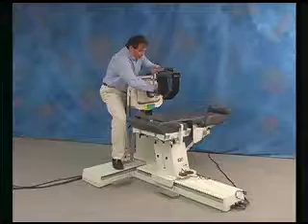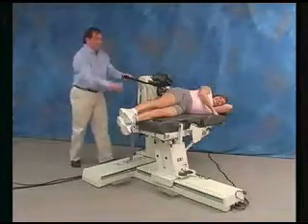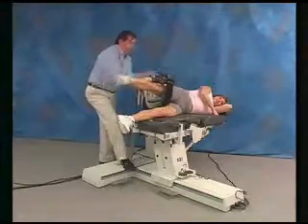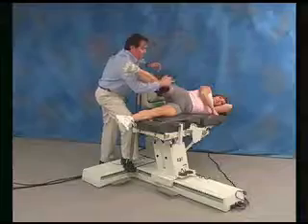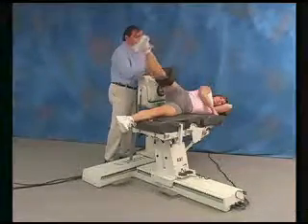Align the axis of rotation. Fix the patient to the attachment. And set the range of motion limits. Take care.